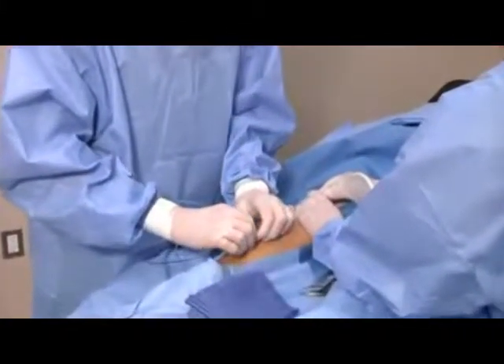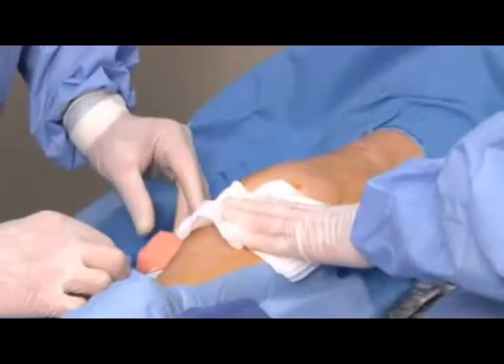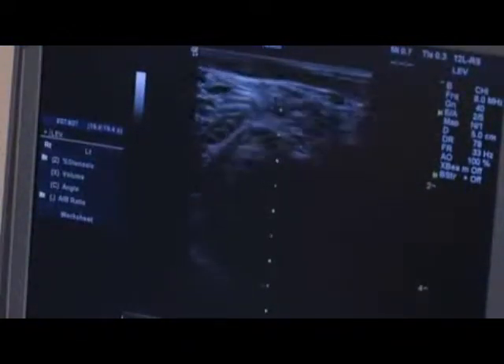John's watching. On the ultrasound screen, we can see the catheter. That's our fifth treatment. The catheter is going to be removed now, and in essence the procedure is near complete. While we're getting ready to apply a dressing, John will re-scan the vein, ensuring that we've got an adequate treatment.